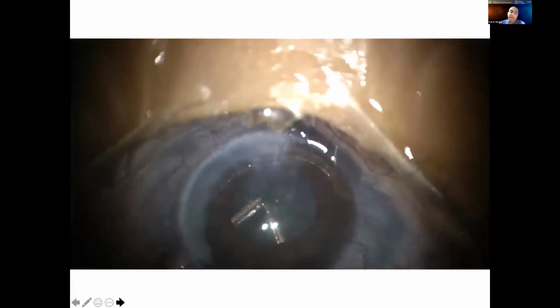This is really important because the endothelial cell loss occurs because of the turbulence of the irrigation fluid up against the endothelium. If you're underneath the anterior capsule, you don't get that. You reduce that loss by operating in the bag. And you'll see here that I use my irrigating cannula every so often to rub the port of my aspirating cannula so that I don't run into problems of not being able to aspirate. You can already see a good red reflex.